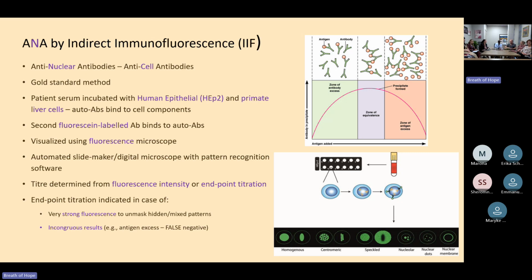So it will say nuclear homogeneous, it will say speckled, but it doesn't differentiate between fine speckled and coarse speckled. And then it will say cytoplasmic, it's got nucleolus, more your broad categories of patterns. So we don't just take the classifier's interpretation. We look ourselves and then decide what we think it should be.